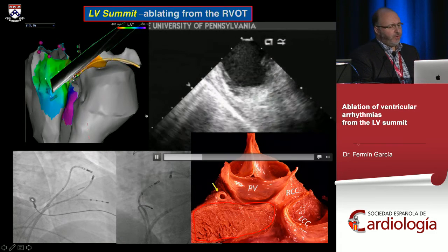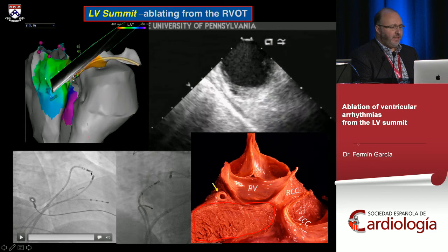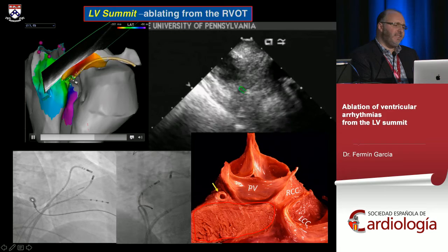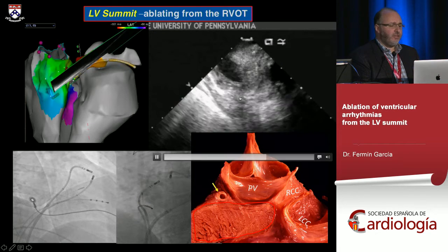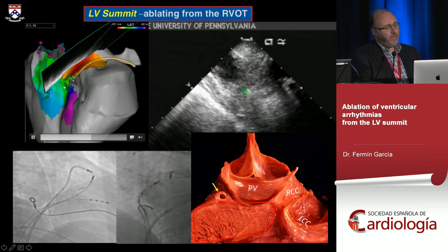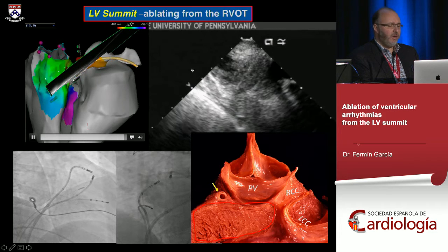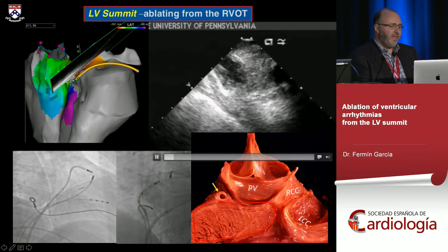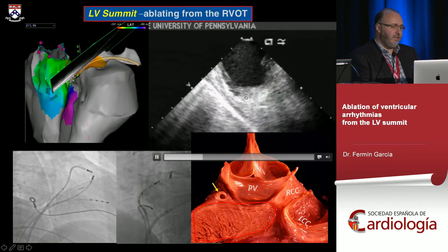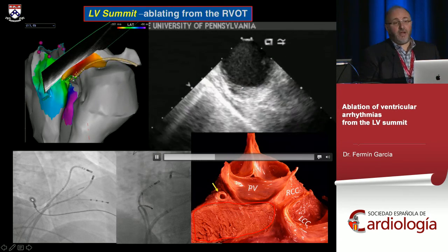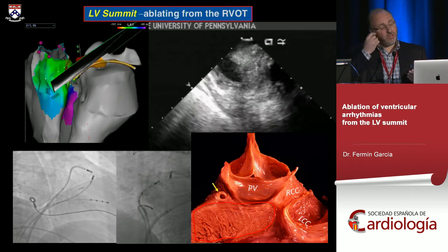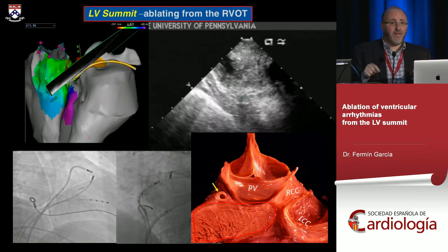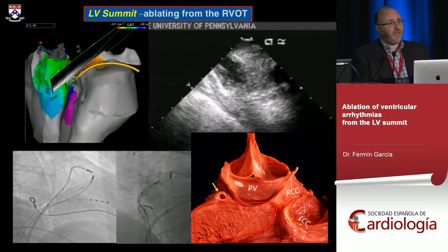The catheter is placed in the AIV — shown on the CartoMap going into a septal branch. On intracardiac echo, when the image captures the tip of the catheter, you can see a green dot showing the RVOT here and the LVOT here — demonstrating how close this catheter is to the septal portion of the RVOT. Anatomy varies from patient to patient, which is why understanding it with ICE is so important — you need to know which of the five spots is best for your patient.